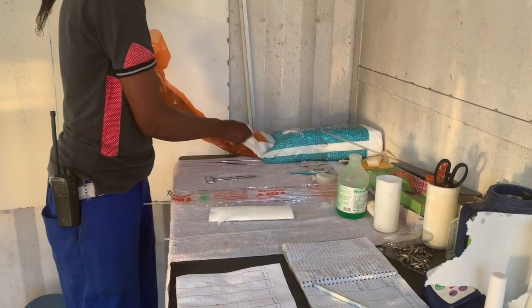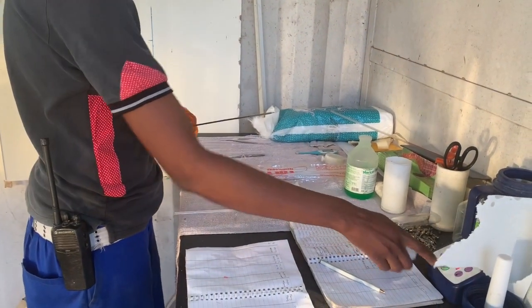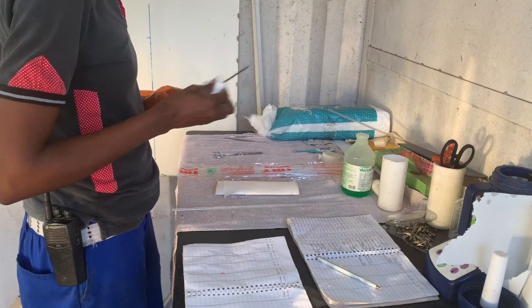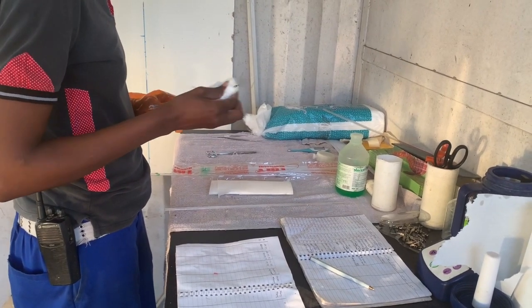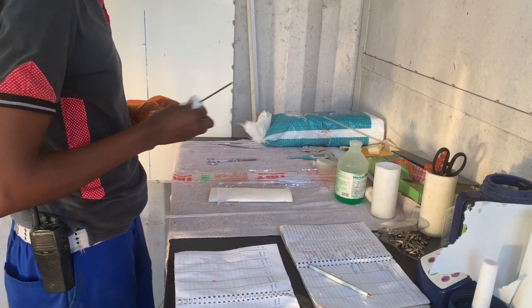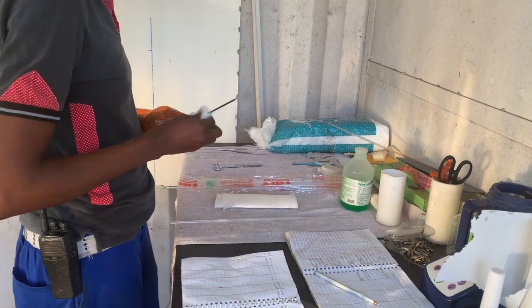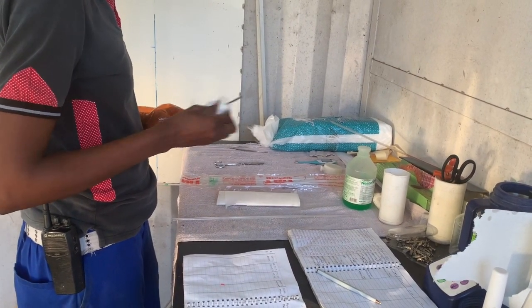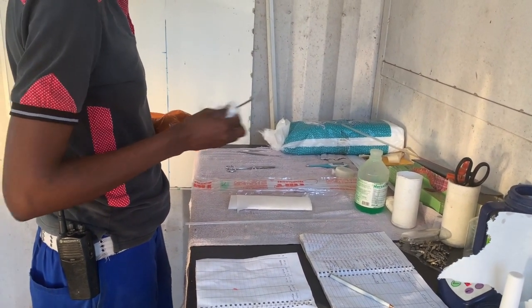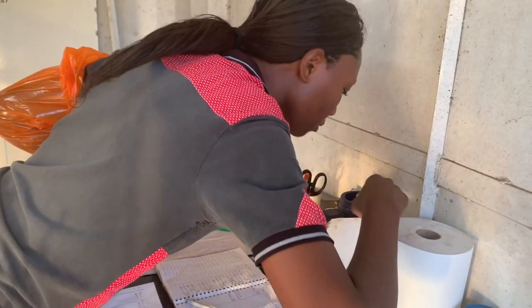Set the timer on your thaw machine to 30 seconds, as this is the minimum time required for thawing. Whilst the straw is thawing, warm up the AI gun by rubbing it with cotton wool so that the sperm do not receive a shock when the straw is placed in the gun. You can test that the temperature of your gun is correct by placing it against your cheek, where it should feel pleasantly warm. If it is too hot, it will kill the semen.